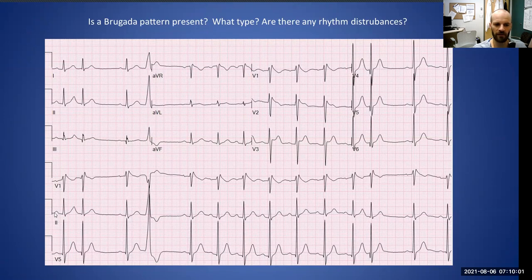So we've got a P wave. This T wave looks different here, doesn't it? It looks kind of spiky, doesn't it? Because there's a P wave at the top here. I think you could be pretty clear that that P wave is related to that one. That one's related to that one. That one's related to that one. No P wave here because this was a PVC.